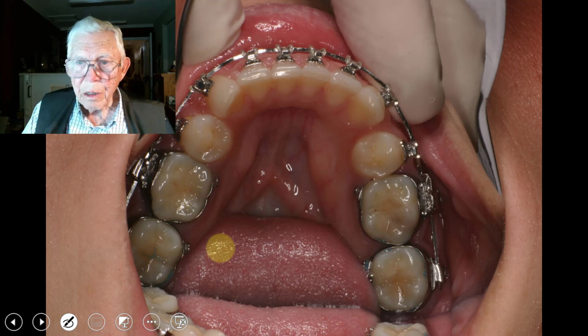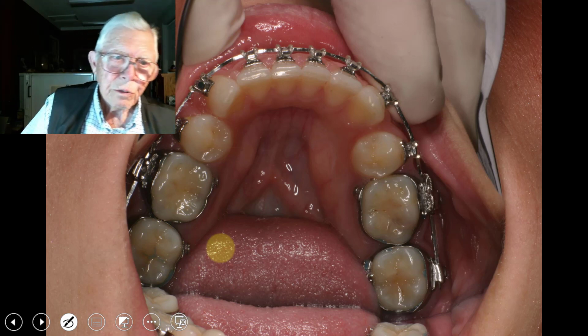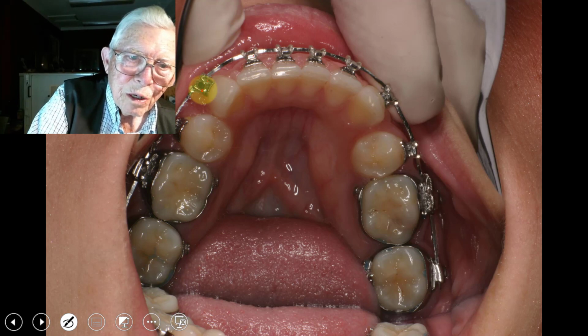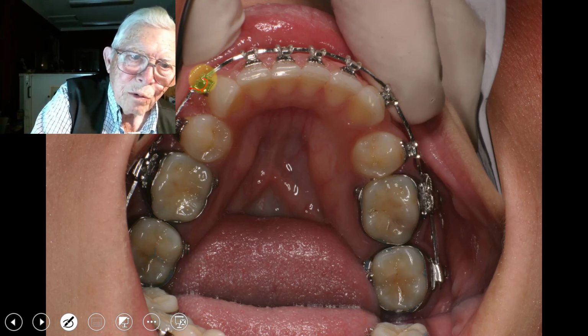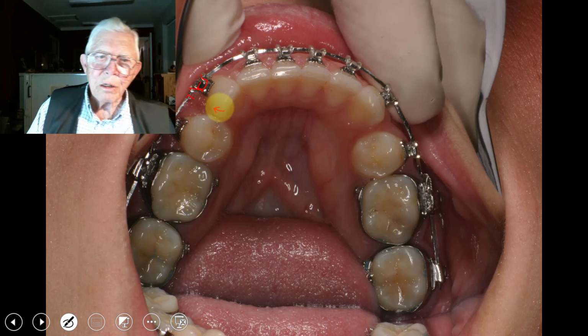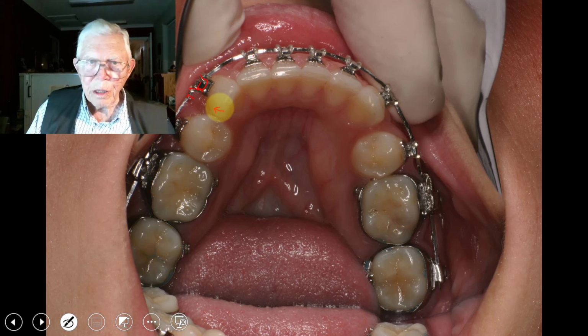Now, on the top, we've still got a little space and got some rotation. And don't try to get an elastic to do something here. See, you can run the wire in right here and come out on this side and put a tremendous pressure. You can push down on the wire and wire it down in there, and it'll make the back tooth rotate a little bit back that way. But don't try to put an elastic on it.